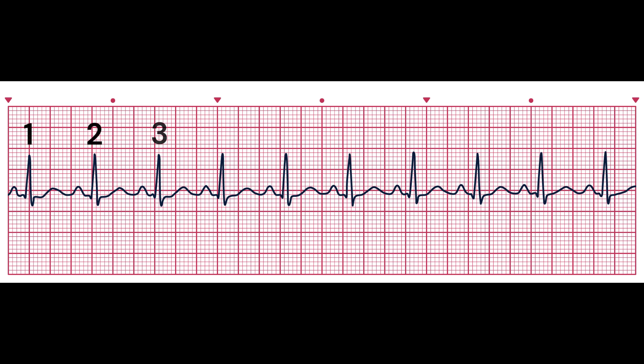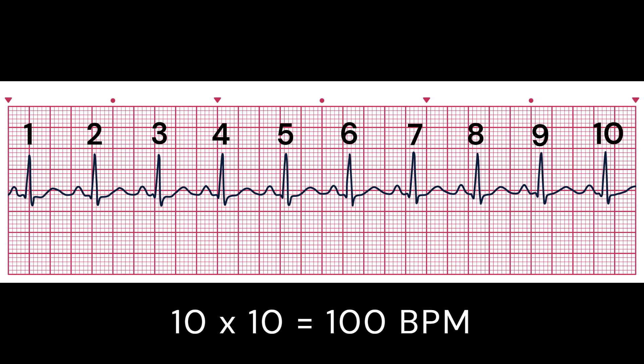The next step is to count the number of QRS complexes — the main deflection on the EKG trace — within that interval. Once you have counted the QRS complexes, you multiply that number by 10 to obtain the heart rate in BPM. In this example, there are 10 QRS complexes in the six-second strip: 10 times 10 equals 100, therefore this strip is 100 beats per minute.